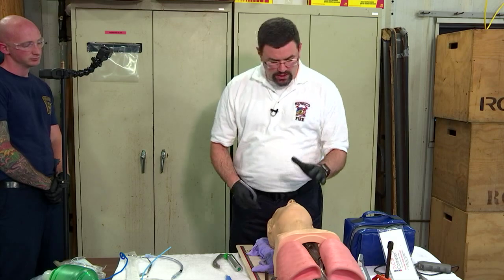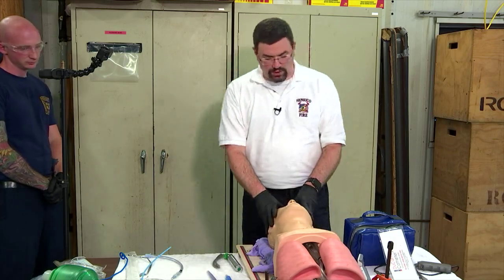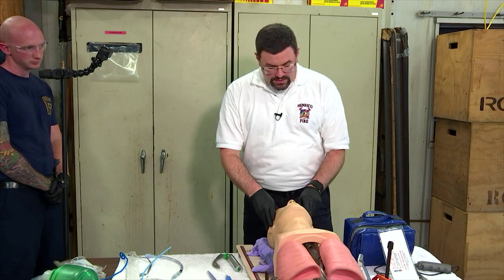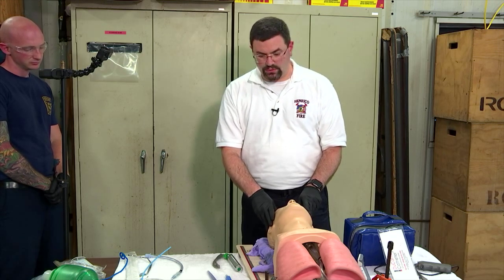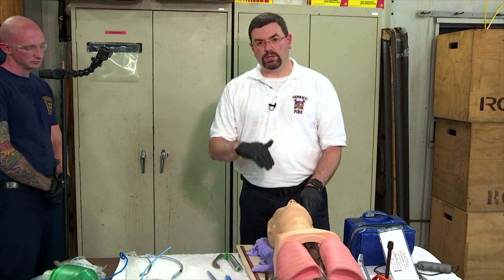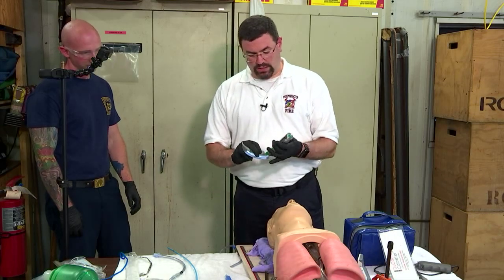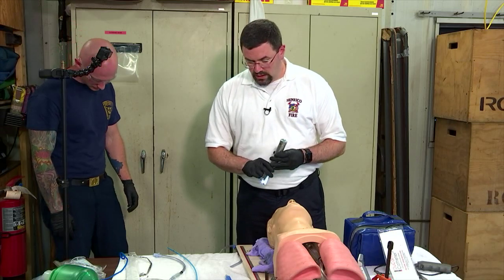So what we have here is our SALAD trainer. Sean has been nice enough to rig this to vomit somewhere in the neighborhood of 300 cc's per second, which, I'm exaggerating, but it's not too far off. What we will be demonstrating is how to suction while you're intubating, and not just clearing the airway, but continually suctioning during the airway attempt. Our first intubation technique is going to be with standard direct laryngoscopy, what most of you guys train with to start with and are most familiar with.